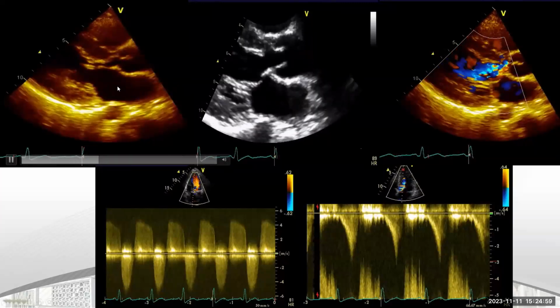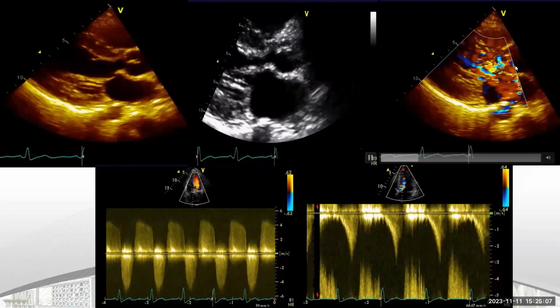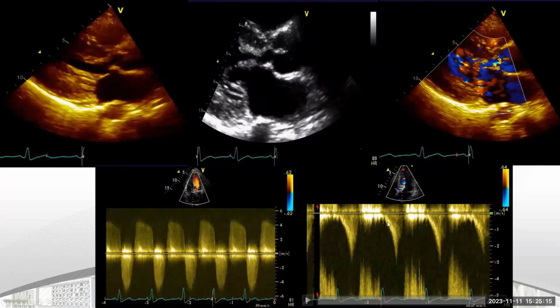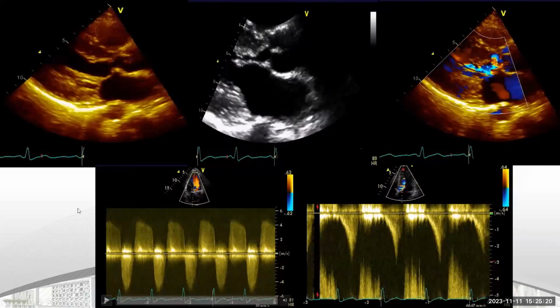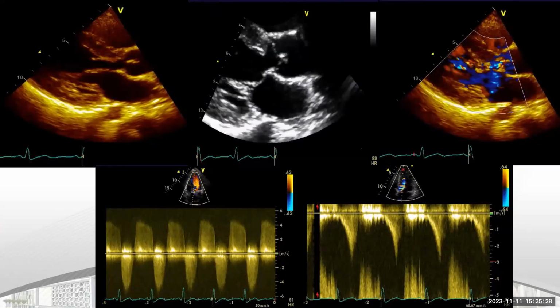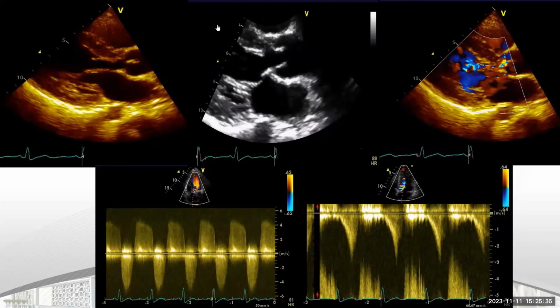So now my diagnosis again: this is subvalvular aortic stenosis because of a subaortic membrane or ridge, and you have also aortic regurgitation. You have aortic valve stenosis as well. So you have the two jets here, the jet of AS by CW across the valve, and the jet of the subvalvular aortic stenosis by pulse wave. So can you give me a diagnosis now? Give me a diagnosis if you have both combinations, AS and subvalvular AS. What could be the disease which can cause both of them?